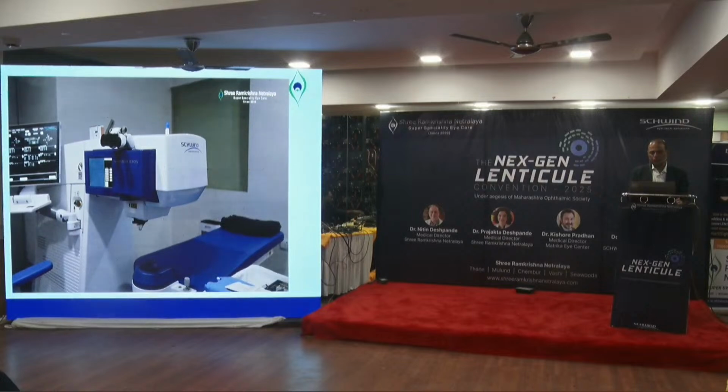So this is how the machine looks. The cone, you can see the patient lies down there, and there is a little joystick on the right side with which you can control the movements of the bed. And you see it through that microscope, and the little screen on the left side of the scope is where you can see what's happening to the eye.